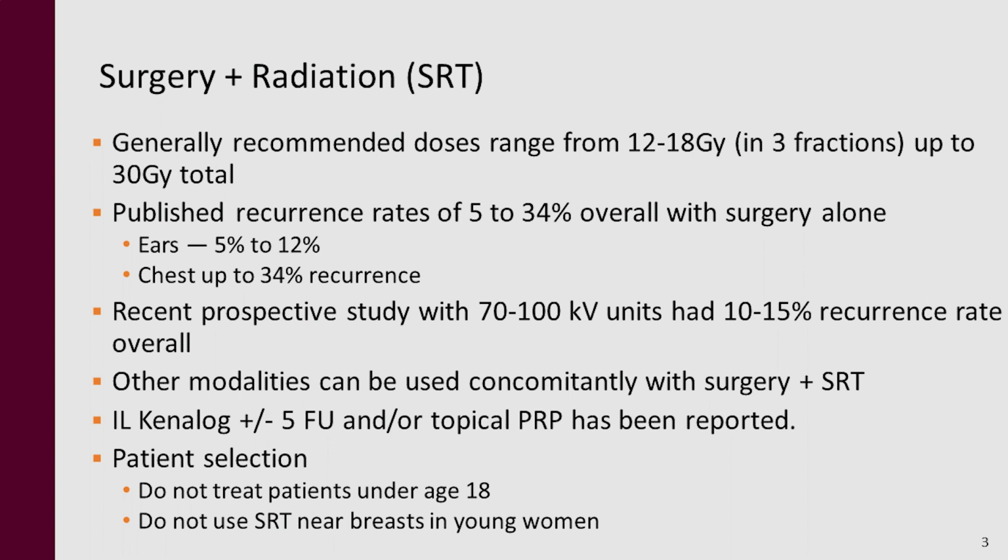Well, in the past, I wouldn't even do it with Kenalog because I've seen so many Kenalog failures, but that's just my bias. But since I started doing it with radiation, I've been much more likely to do it. One of the recent studies with a 70 to 100 kV unit like mine had about a 10 to 15 percent recurrence rate overall. Hopefully, on the ears, it should be much less than that, but you can never promise a patient that it's going to work. But so far, they've all worked.